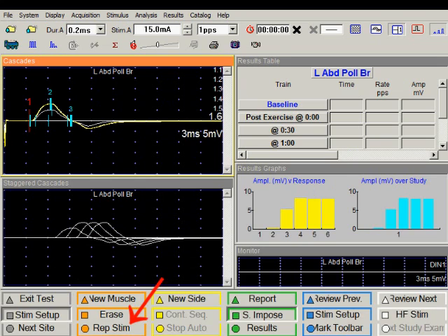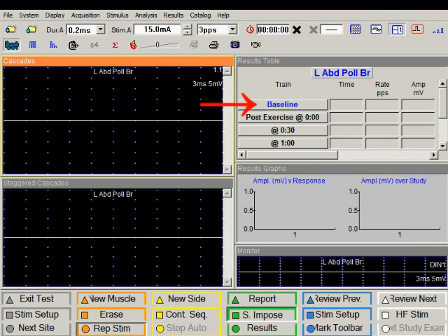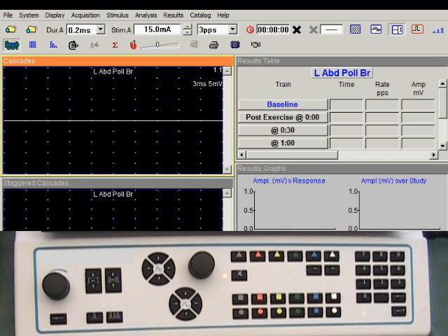I will now start the repetitive stim modality. The stimulus frequency is 3 Hertz or 3 pulses per second. I'm going to deliver the baseline train of 10 stimuli. Push the recurrent stimulation button.